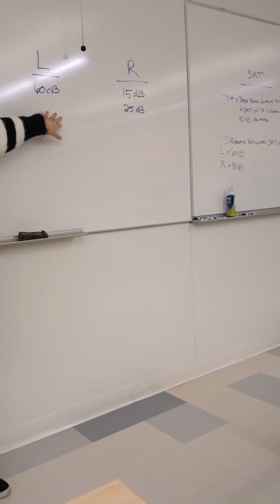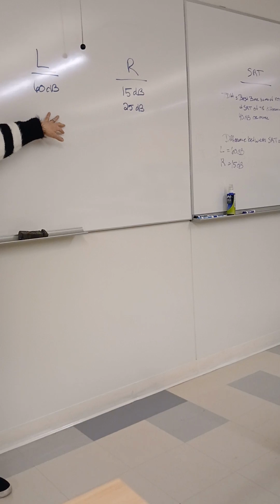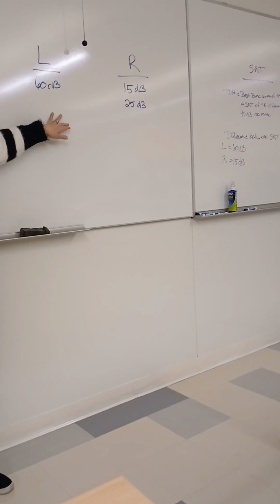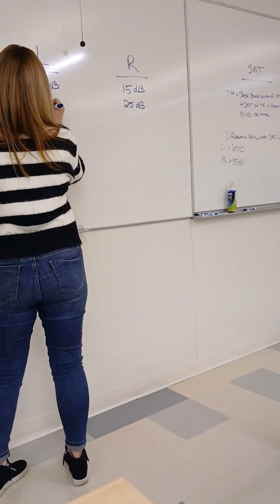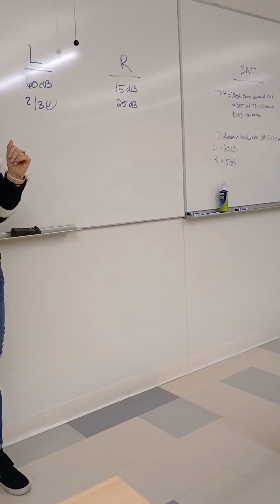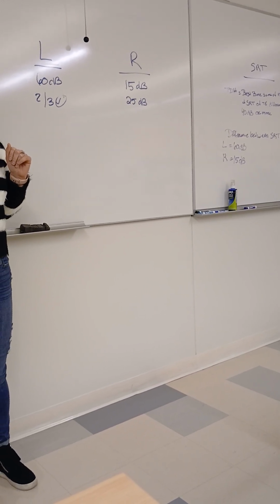And then when we're doing SRT, how many do we want at one level? Is it 2? 2 out of 3. Yeah. So you're correct. You're on the right path. 25. So you want 2 out of 3. So if let's say we get our 2 out of 3, now what? Go up. We're using our ascending, our plateau method. Increase masking by 5. You got it.